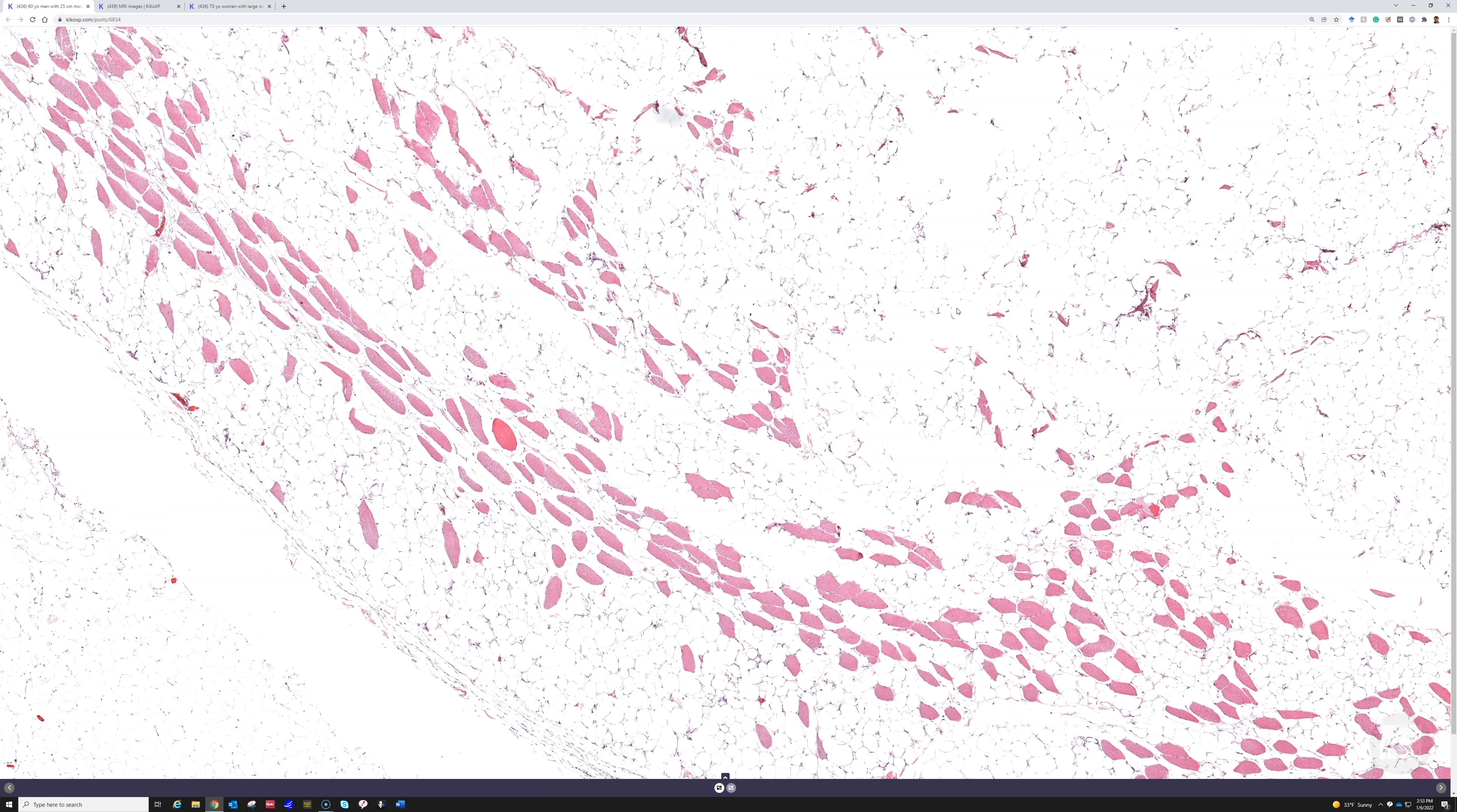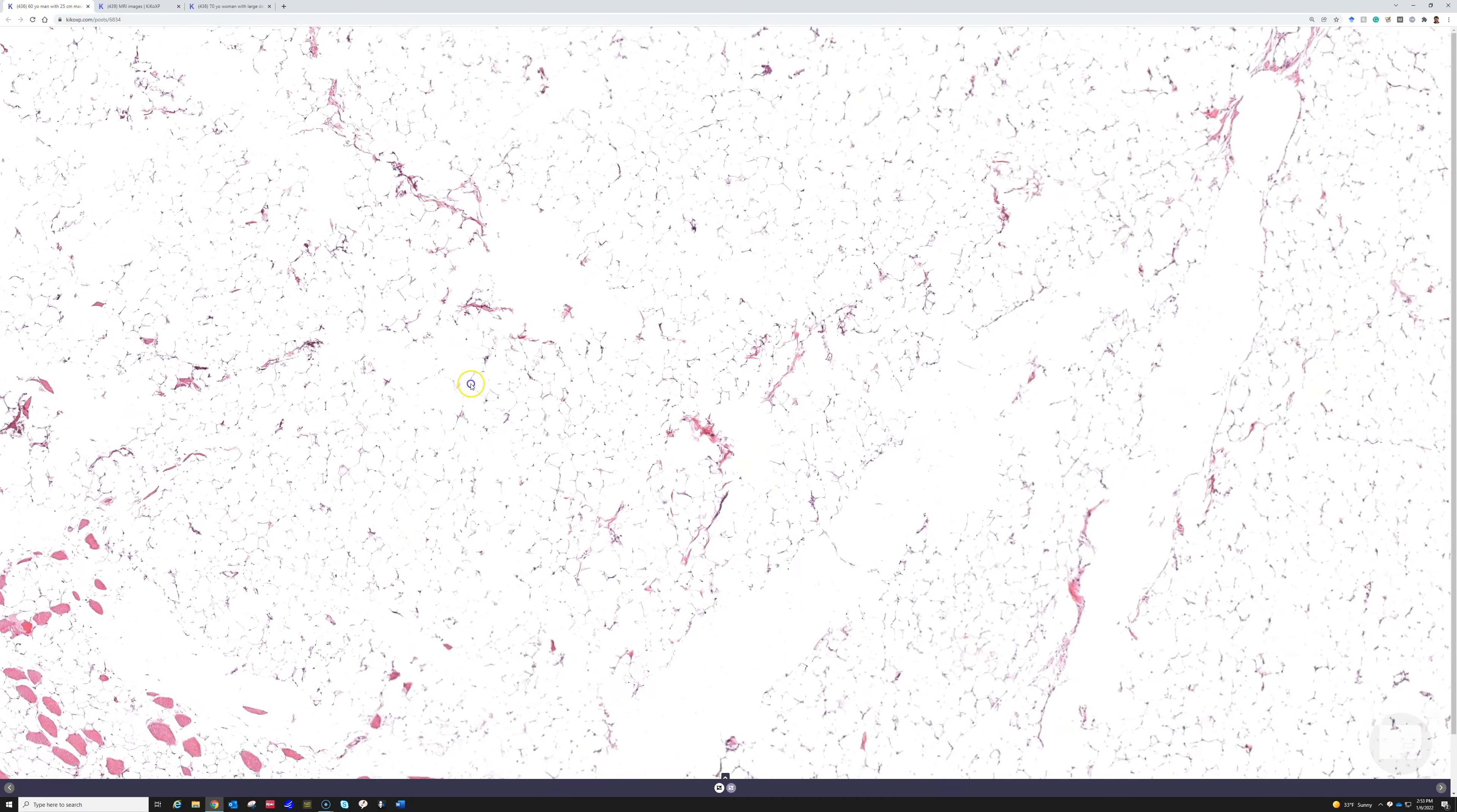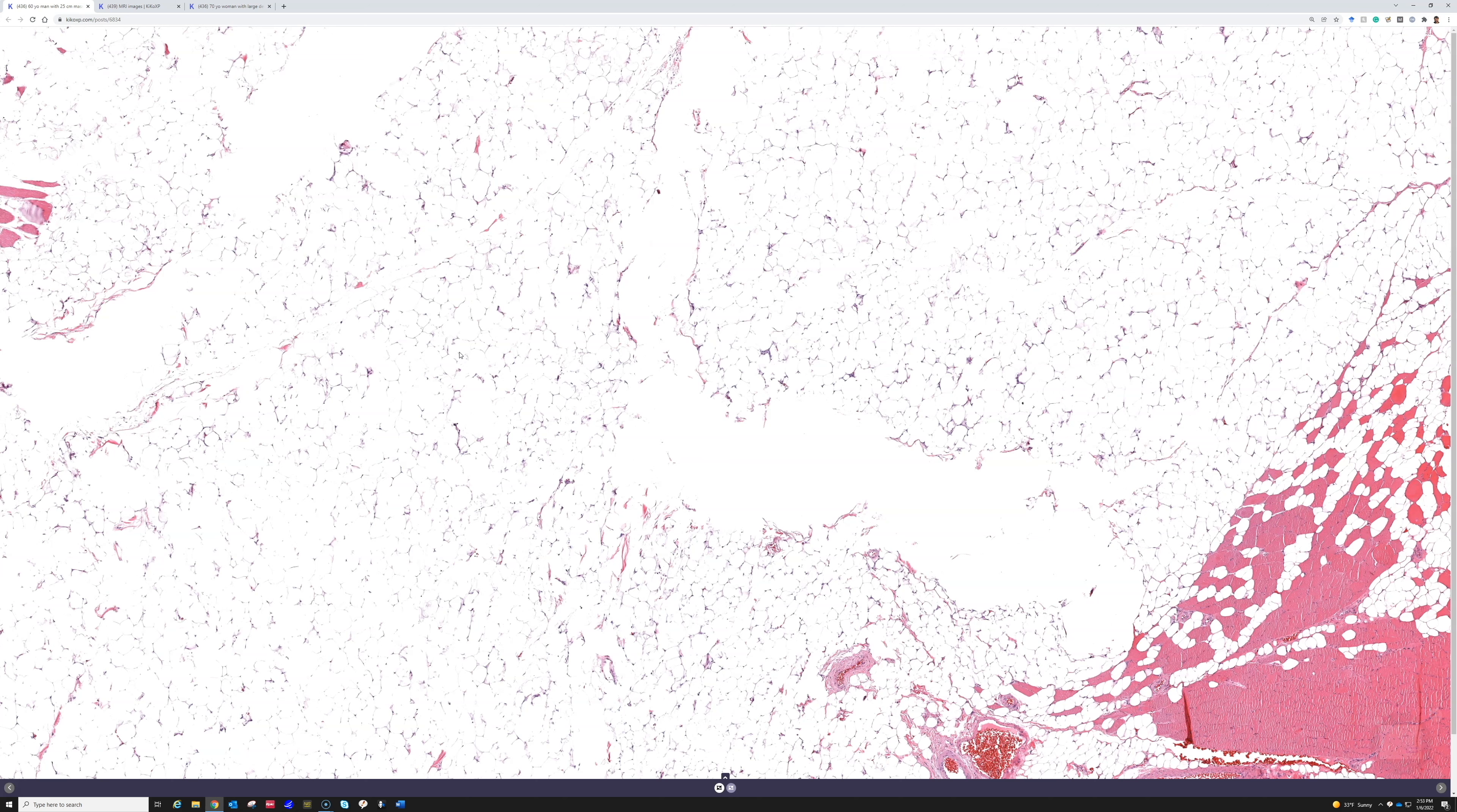Okay, and so the one way is we look for atypia, right? And if we don't find any atypia and it just looks like a lipoma but it's this big, usually if it's bigger than 10 centimeters I'll do FISH for MDM2 just to be sure. Because I have seen rare examples of ALT that had no atypia at all and look just like a lipoma. I mean very rarely, but I have seen that before.